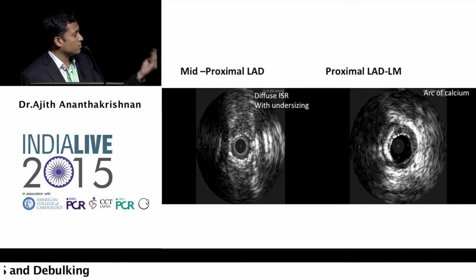But as we come proximally to the LAD, we can see that it's a 3.5 vessel, and this 2.75 stent is hanging in it. So the operator has not optimized the proximal stent with aggressive post-dilatation. That was a problem which was leading to in-stent restenosis.